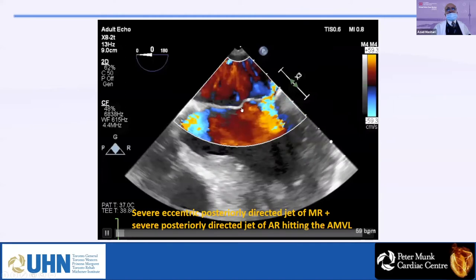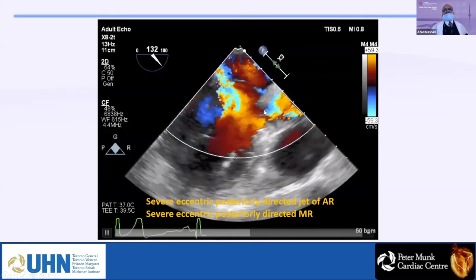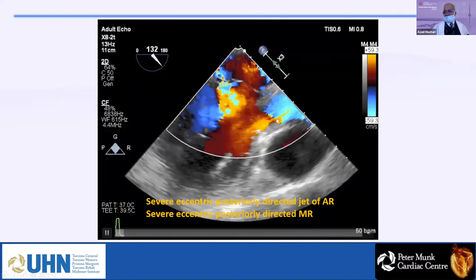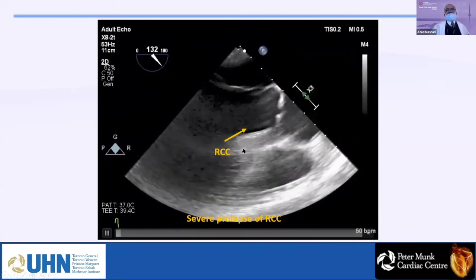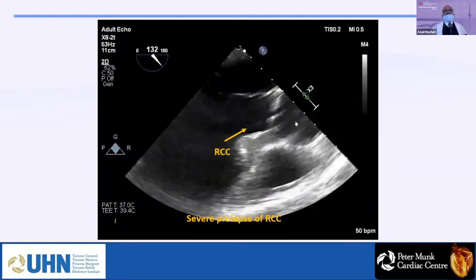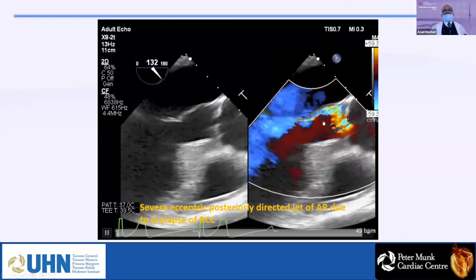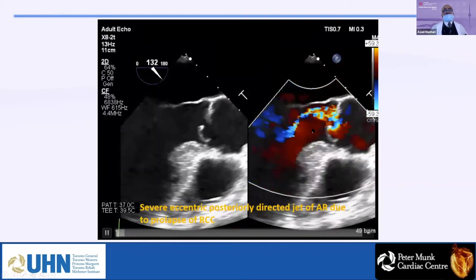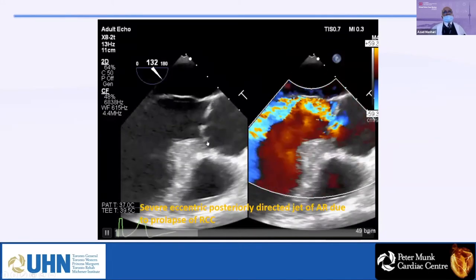This AR is very eccentric and is hitting the mitral valve. In the long axis view, you can see the severe eccentric posterior-directed jet of AR hitting the mitral valve. Without color, you can see the prolapse of the right coronary cusp. The direction of the AR jet helps diagnose which leaflet is prolapsing — a posterior-directed AR shows the prolapse is mainly in the right coronary cusp.